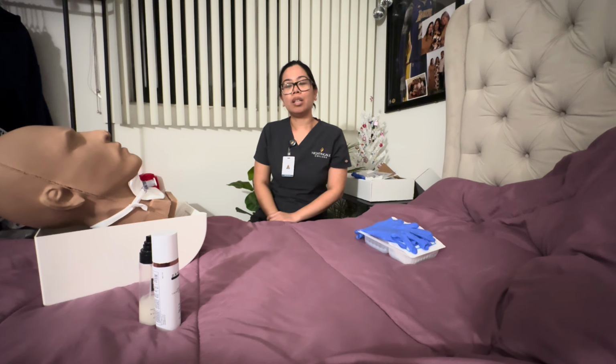We want to put on an oximeter for the entire procedure, because we'll be removing the oxygen source. So we want to see if the patient is tolerating the treatment by having that oximeter on.